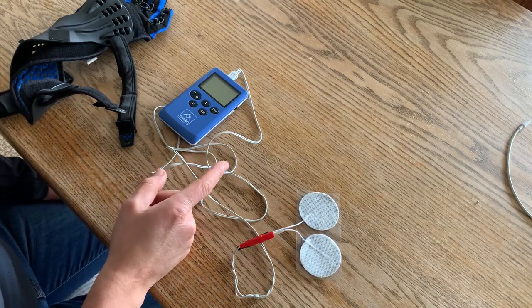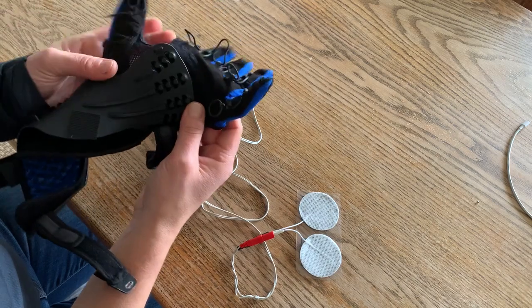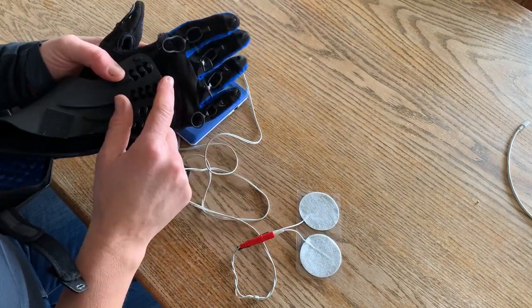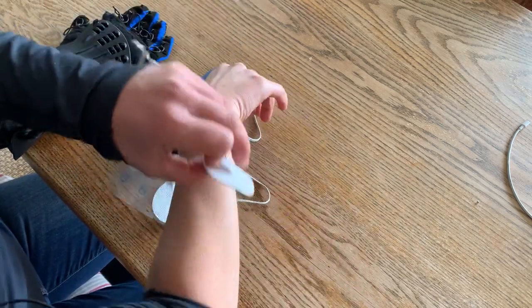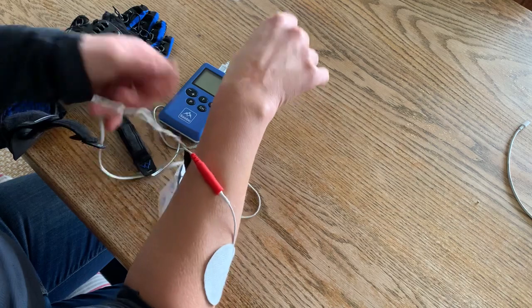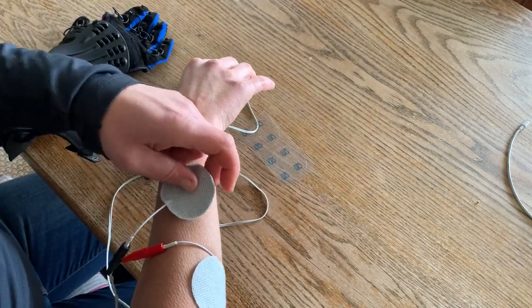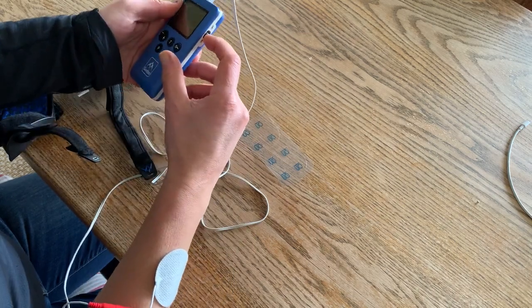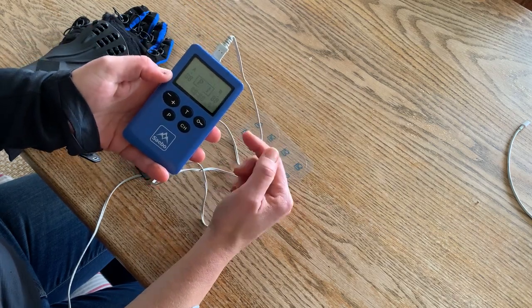I'm going to show you how you can combine the Sabre Stim Pro and Sabre Glove. If you're finding it's a bit difficult to open your hand even with the Sabre Glove, you can add in a bit of extra electrical stimulation to help. I'm just sticking the electrodes on first.